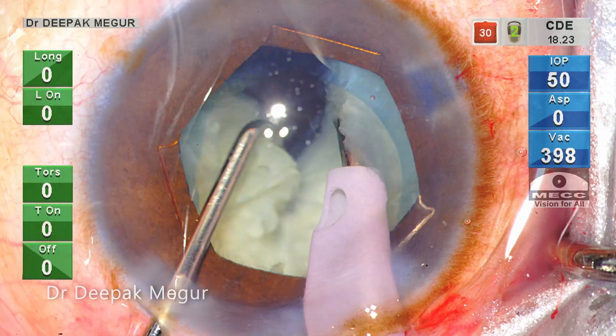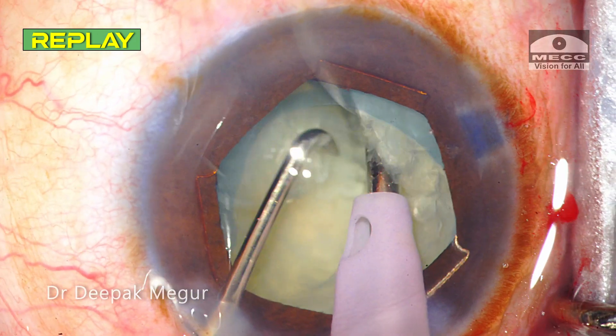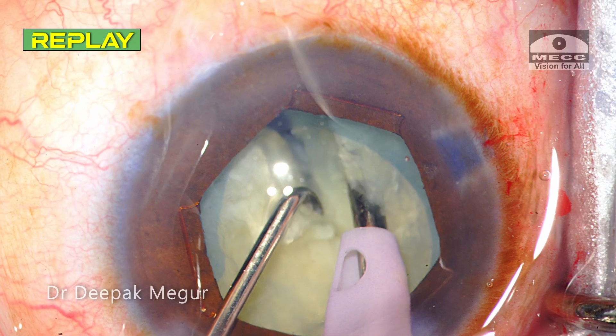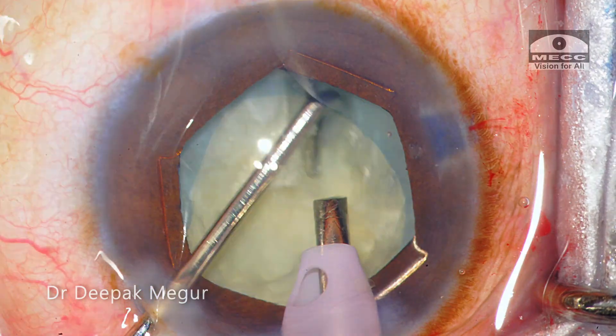We can see that the posterior plate is not cracking. This is primarily because the incomplete rhexis is constantly playing at the back of my mind, so I'm subconsciously trying to be extra safe and hence my lateral separation maneuvers are not adequate enough.